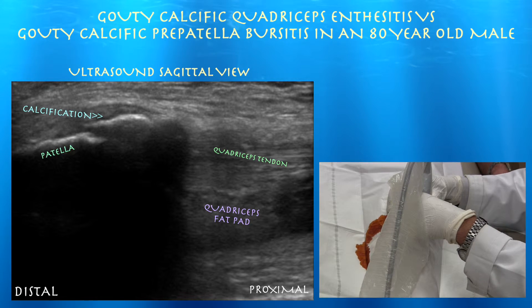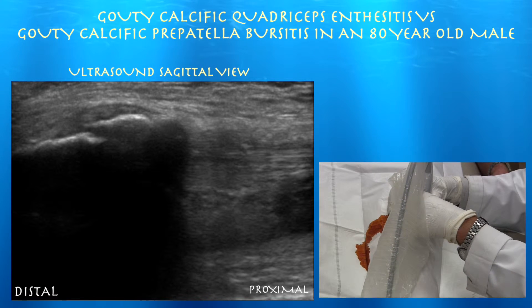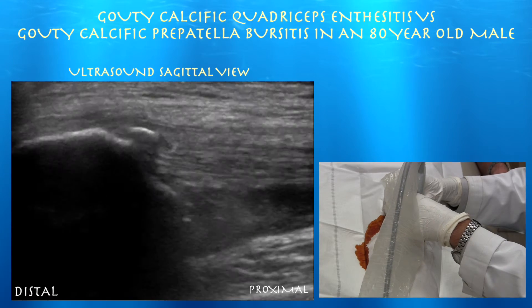I'm going to use only about half what I normally use with cortisone, given the fact that it's right on top of his quad tendon. We're not going to inject the quad tendon itself — just going superficial to it — so I don't think I have to worry too much about weakening the tendon, but we'll still be cautious and use half the dose. He is tender right at that calcification, so I believe that is his pain generator.